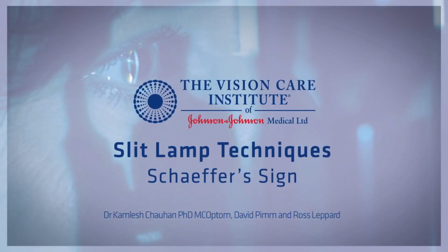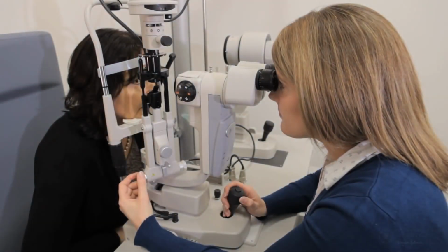The majority of retinal detachments occur anterior to the equator, where the retina is hard to visualize without techniques such as scleral indentation. As a result of this, we need to have another indicator for retinal detachment, and this is what Schaeffer's sign or tobacco dust is. It is a release of blood cells or pigment clumps into the anterior vitreous that indicates that a rhegmatogenous retinal detachment has occurred. In fact, a positive Schaeffer's sign is assumed to indicate a retinal detachment unless proven otherwise.